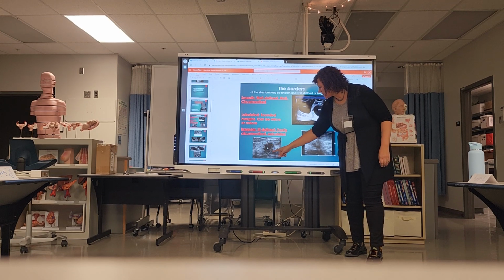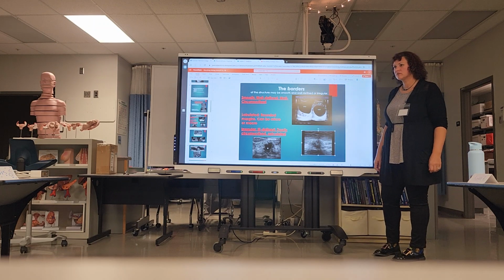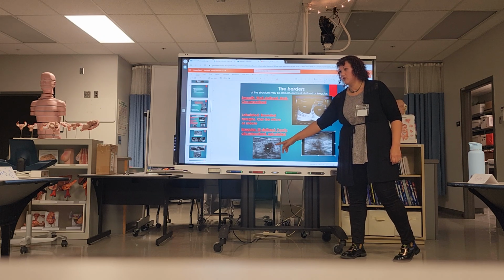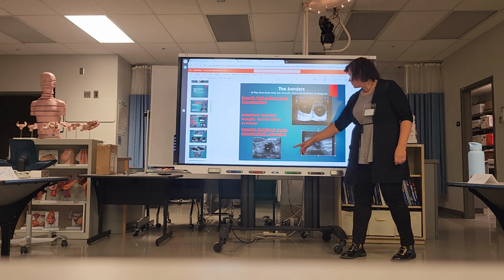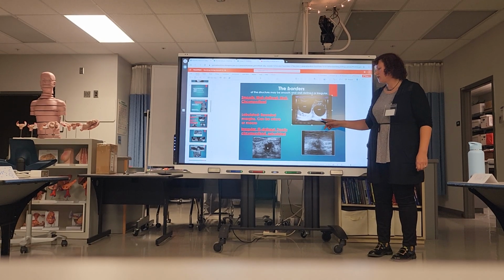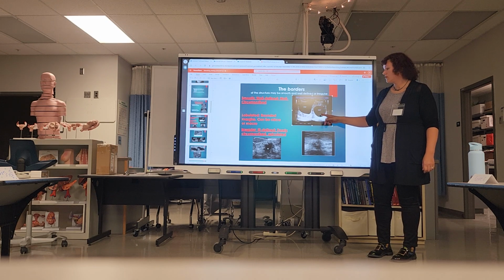So these spikes are called spiculations. What's the difference between this anechoic and this solid? This is not anechoic. If it's anechoic, that means there's fluid inside, and if there's fluid inside, what would it have underneath? Enhancement. The top one is anechoic. The bottom is heterogeneous.